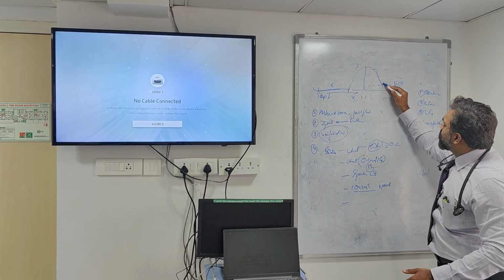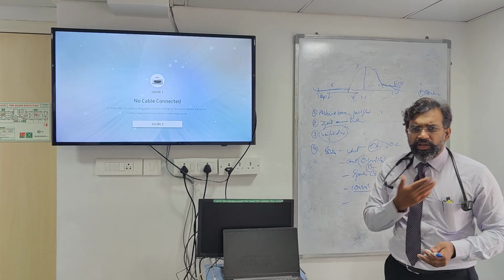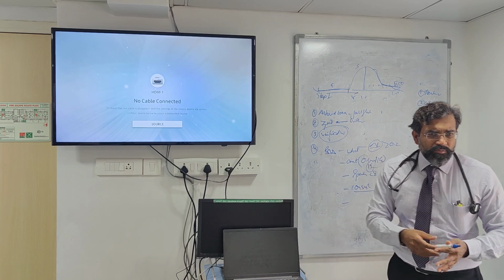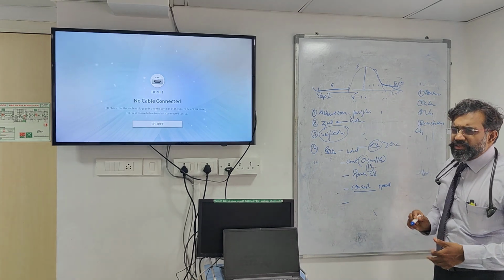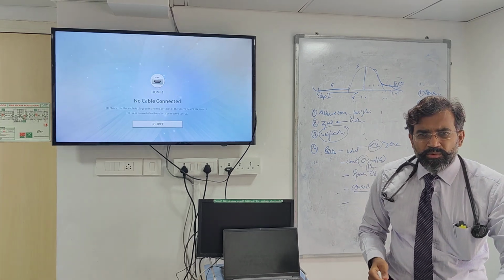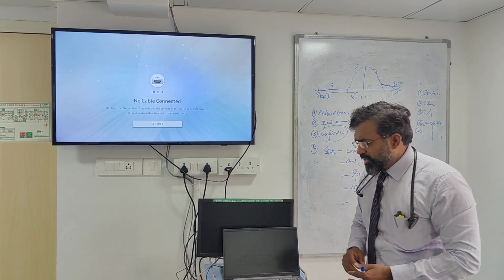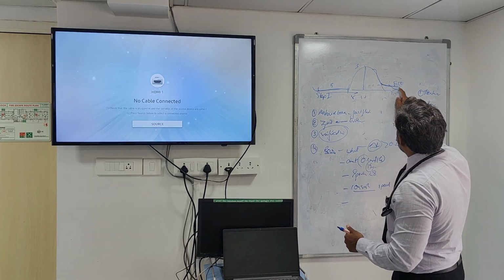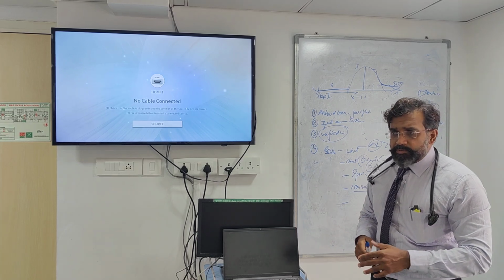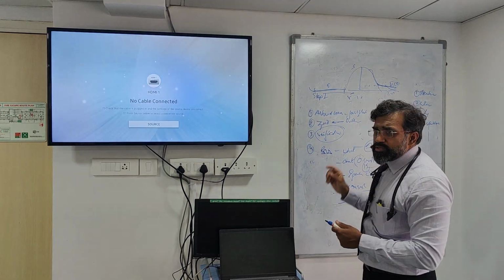Okay, so at this inflection point, it doesn't reach the baseline because then it is recirculating. It will not become 0. It will not become minus 8 degrees, because after that all the blood has mixed. Since all the blood has mixed, the temperature will not decay further. It is not going to reach 8 degrees; it will stay higher. It is not going to return below that. Understanding? That's why it remains higher than your baseline. Clear on this?